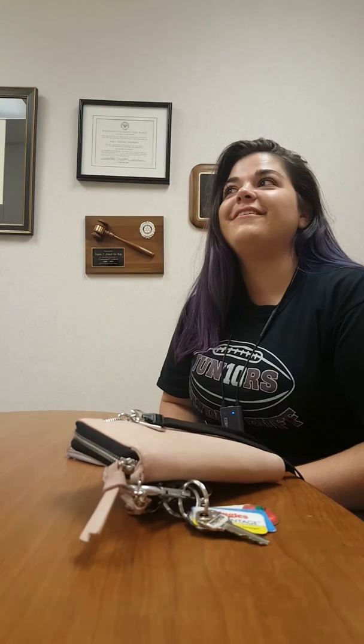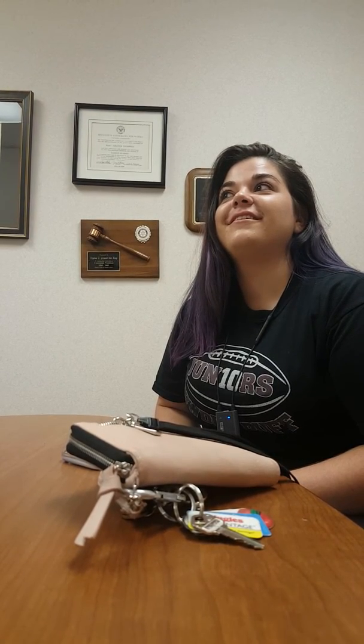Okay, turn that way. I love you. Did you hear that? No — did you say something? I whispered. Well, I thought maybe she'd be able to hear it. Try saying it just a little bit louder. I love you. I love you too! See — all you did was give yourself just a little more voice. Yeah, that's still a whisper. It's like there's a speaker in my ear. Mm-hmm, 'cause there is!